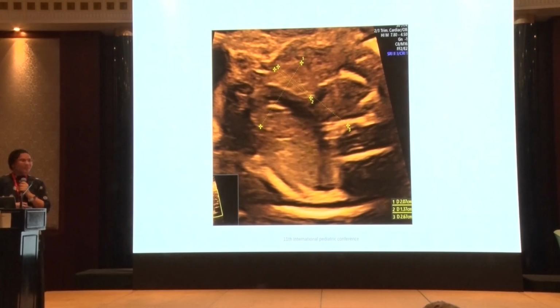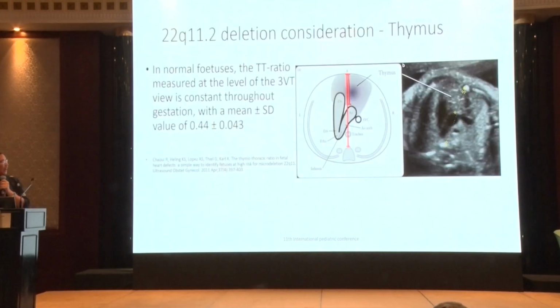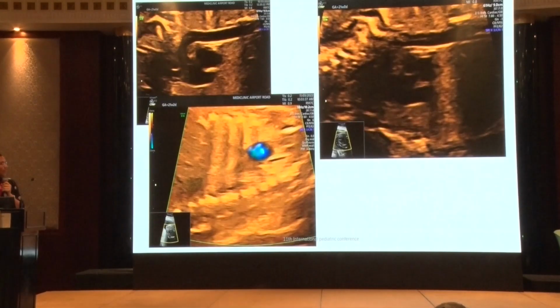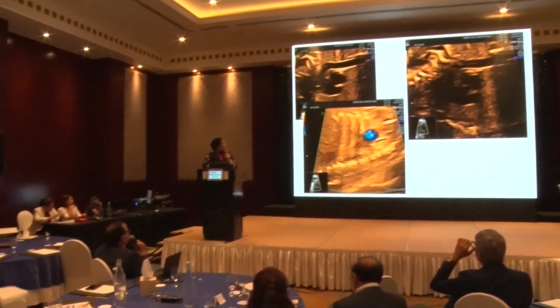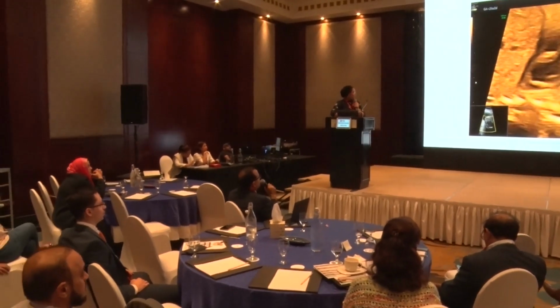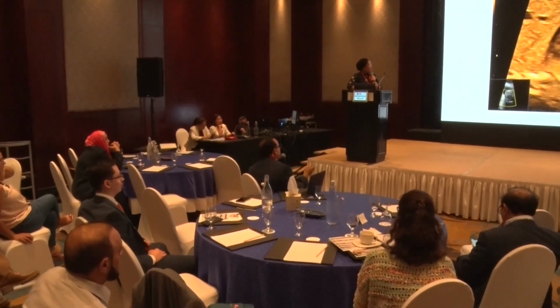Yeah, Dr. Suleiman, you almost convinced me there is another vessel more anterior, separate. Really, Dr. Suleiman, this work I did with Professor Siham, actually. I was telling her I'm always seeing another vessel. Okay. Yes, this is number 1.